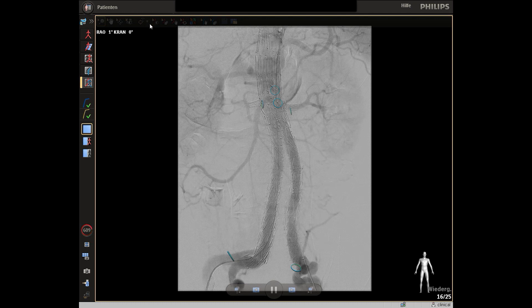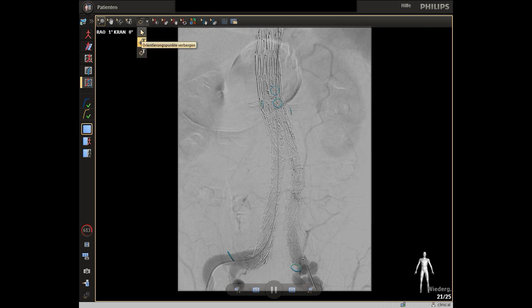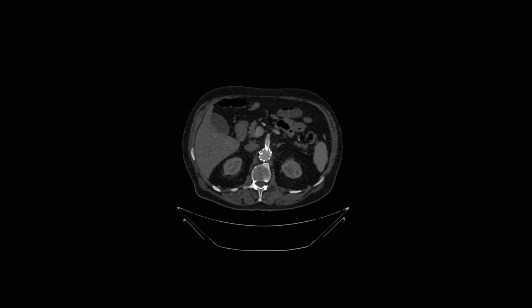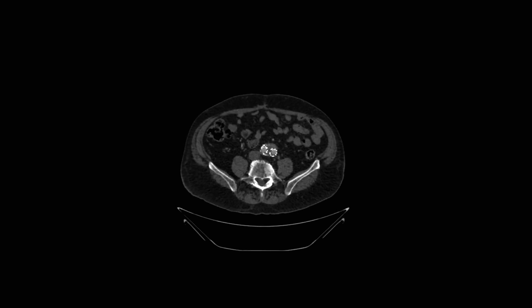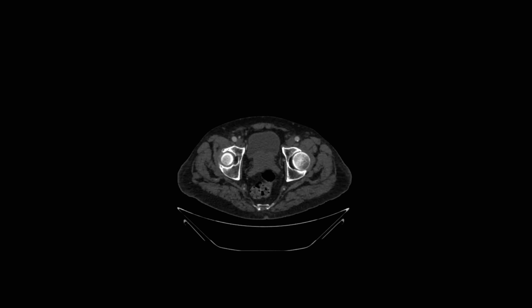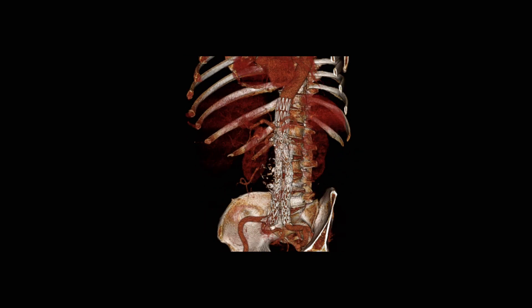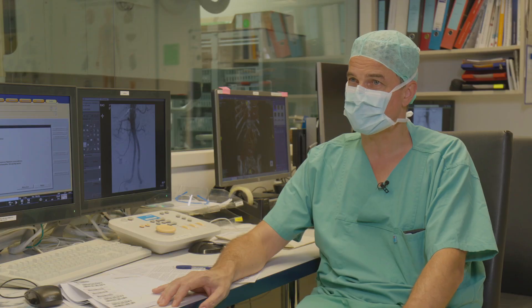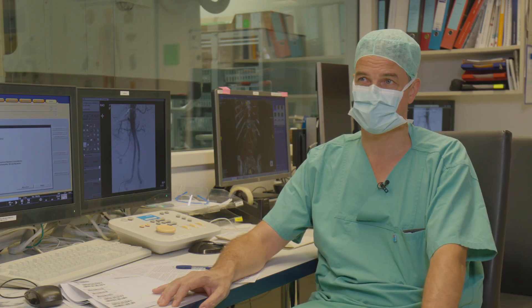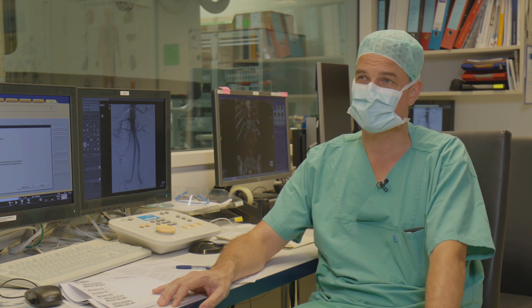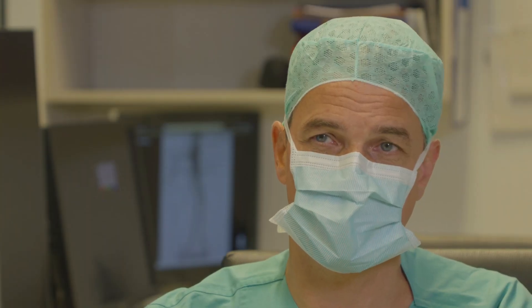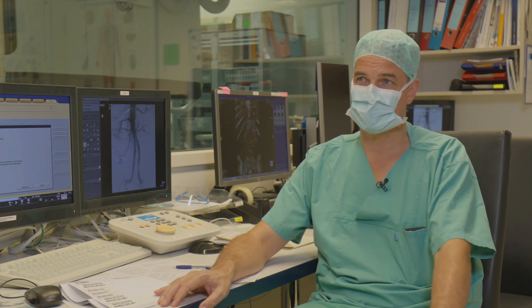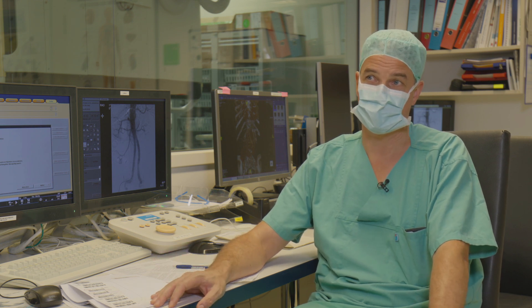This is a good result in a quick procedure performed with FOSS technology. In this case, it was especially helpful to have FOSS available for the superior mesenteric artery. There was one stent strut of the bare stent that was crossing the ostium and we had to go around this so that the bridging stent would not be compromised by this stent structure. Having two different projections — lateral and AP — available at the same time helped us significantly to maneuver around this structure and get our bridging stent in a safe place. FOSS technology in my view is a very promising technology for any endovascular intervention of the future, as it gives us not only colour images but a three-dimensional view of what we are doing without radiation.